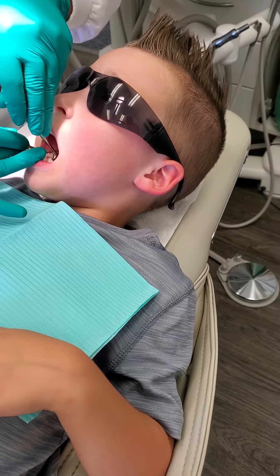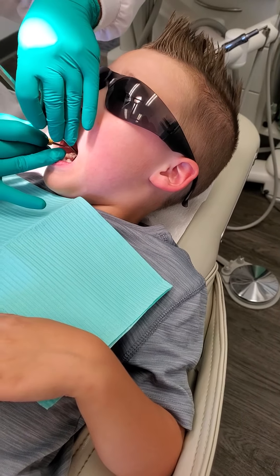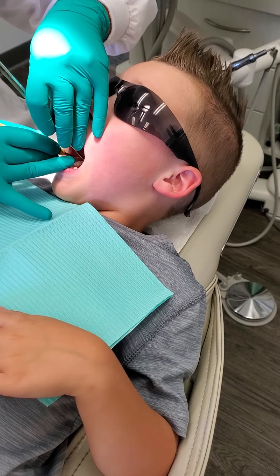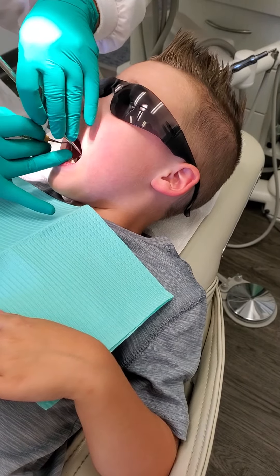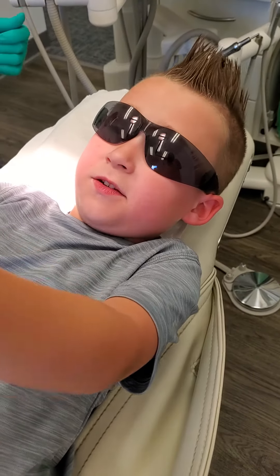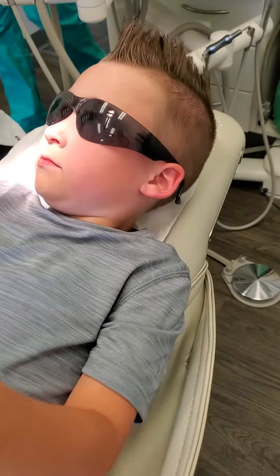Alright, I'm gonna get the last tooth back here — it's way back here — so open big. Good job, look at you! And there was — was there 10 on the bottom? Look, look good!